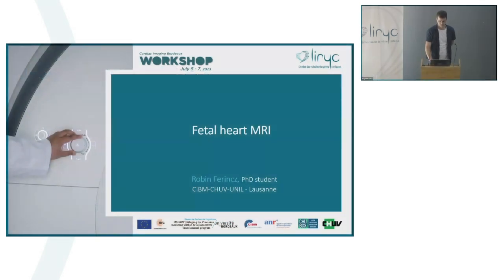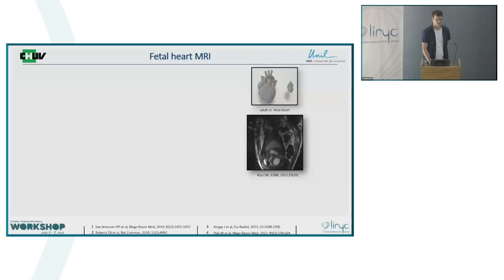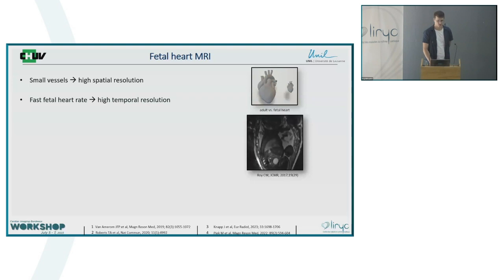So yes, the realization of fetal heart MRI has some special requirements, like for example having high spatial resolution due to the small fetal vessels and chambers, having high temporal resolution due to the fast fetal heart rate.